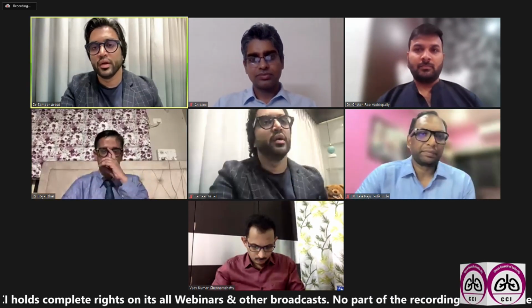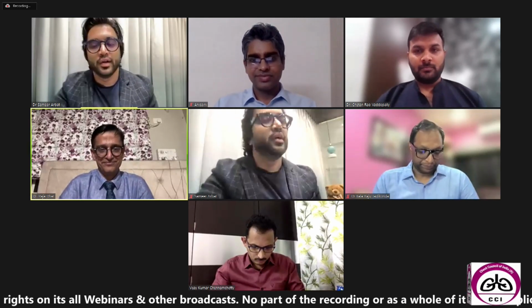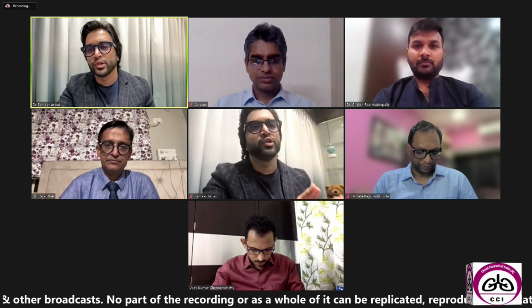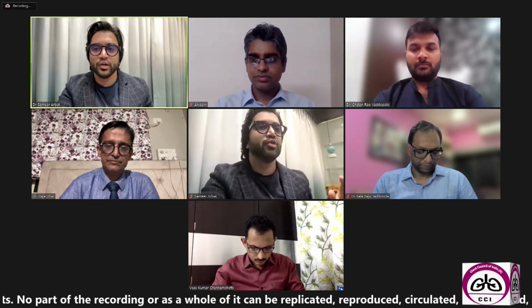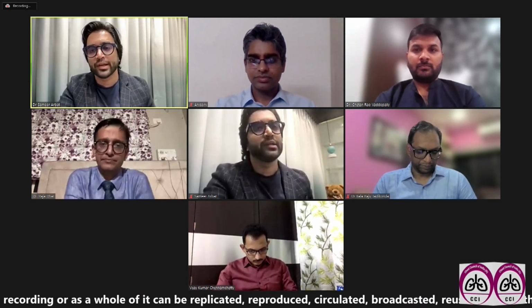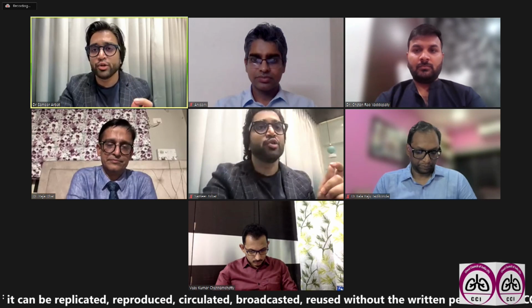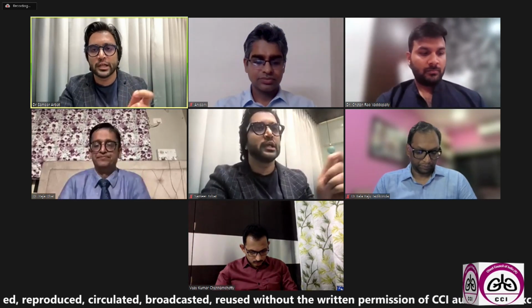Samir. Yeah. So very good evening, sir. Hope I'm audible. Loud and clear. Yeah. So coming to your question, there are two ways of looking at it. One is why is the procedure termed to be safe? When we talk about cryosensitivity, there are different tissues which are cryosensitive and there are certain tissues which are cryoresistant. So in theory, the cryoprobe is resistant to your cartilage basically. So the cartilage is not something that your cryoprobe will stick onto.